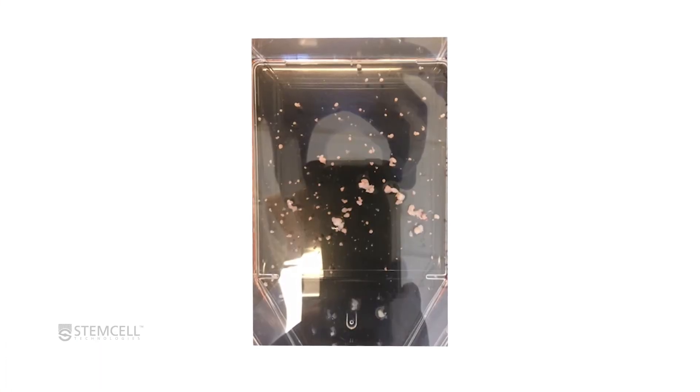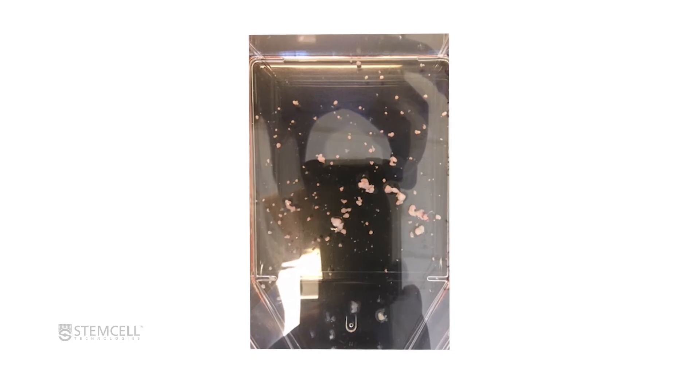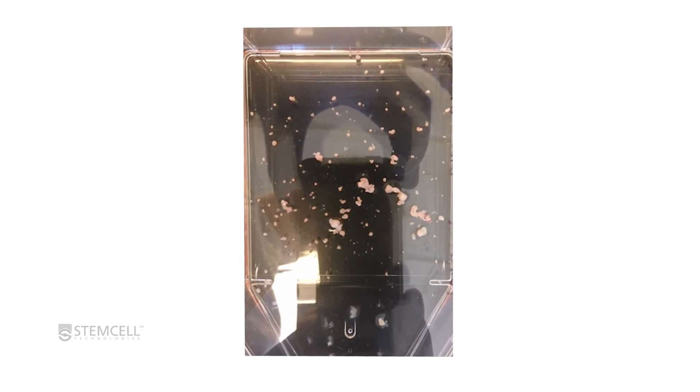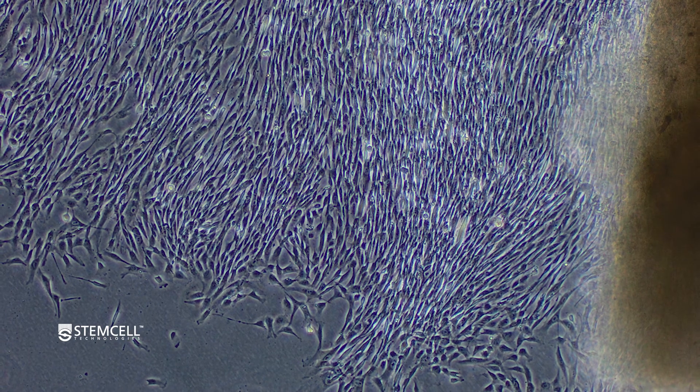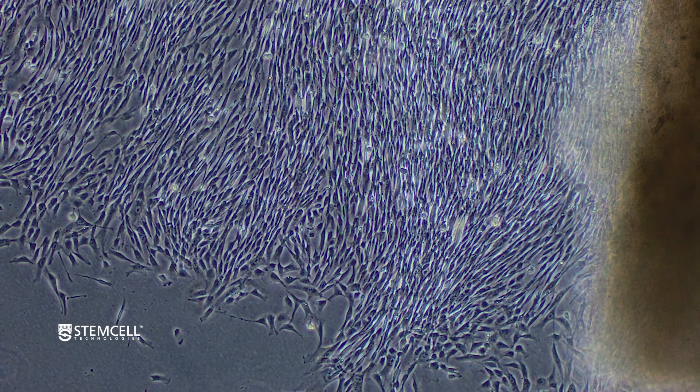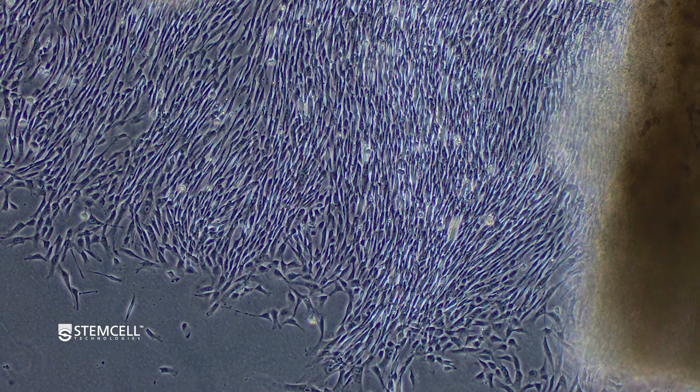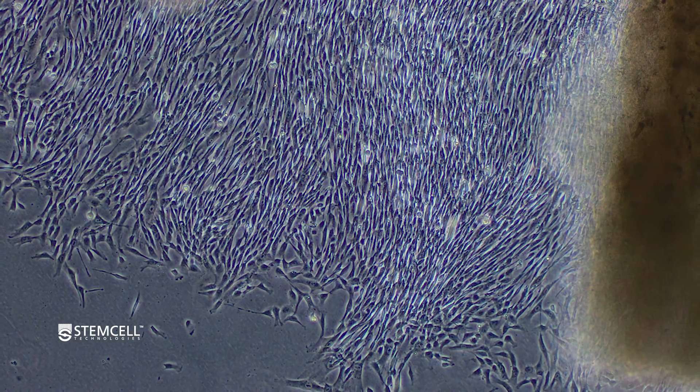After 10 to 14 days of culture, the tissue pieces may start to condense into compact round balls and detach from the flask. This is an indication that the cells are ready to harvest. If the tissue is still attached but the cells have become confluent, this is another indication that it is time to harvest the cells.